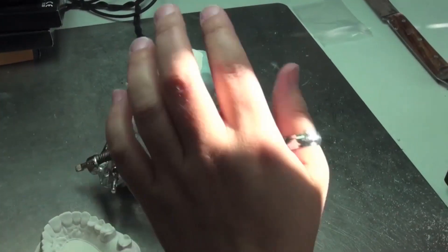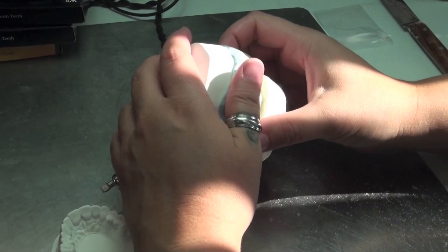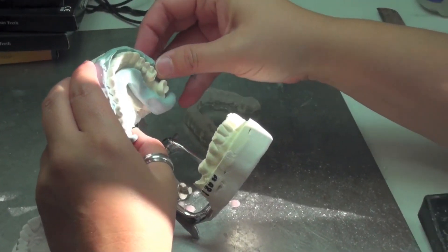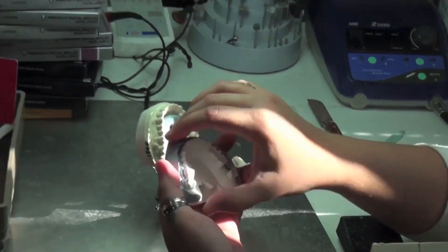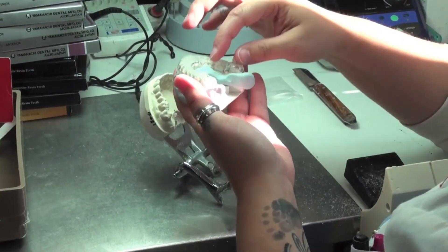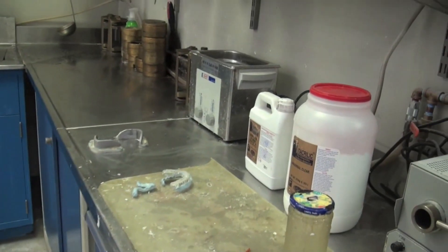To keep the same distance of the tray in this spot — because now I have to reline this with soft material — just to save time instead of articulating, I can put this putty. You know it fits right on this model exactly how I need it to. So now I could reline this and it'll sit at the same level like it will on the articulator. This takes a different material.